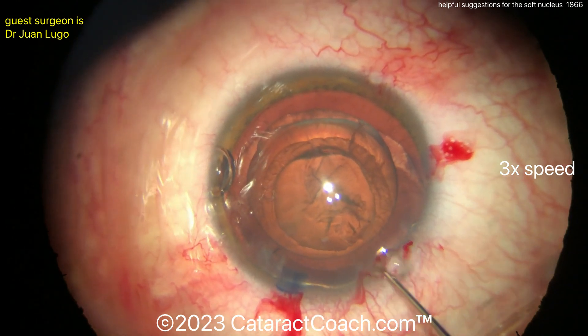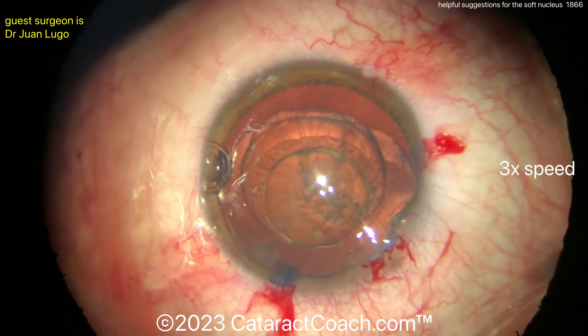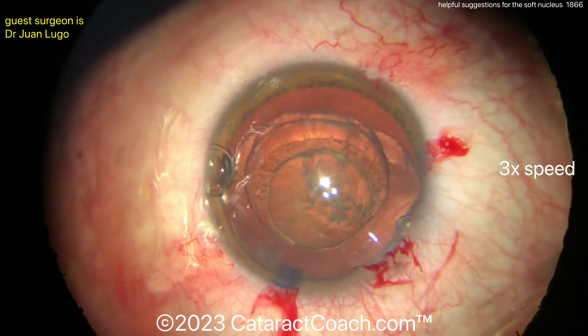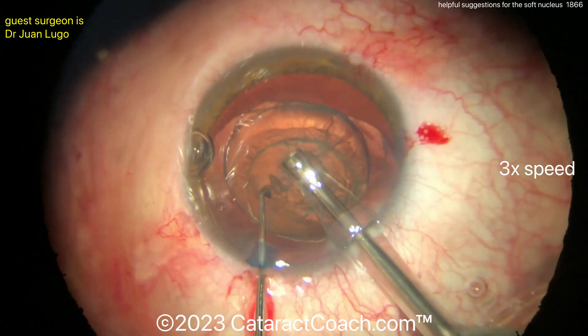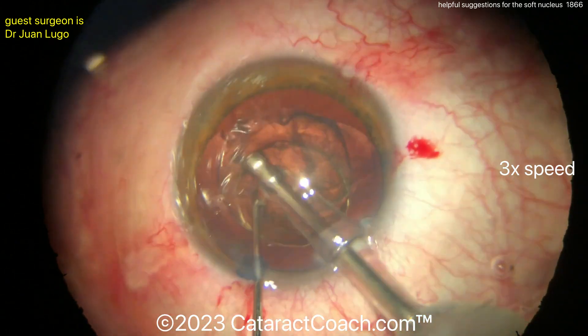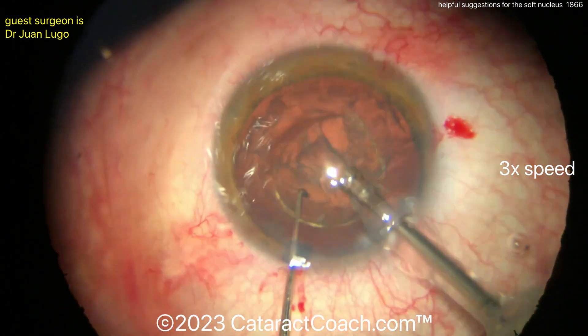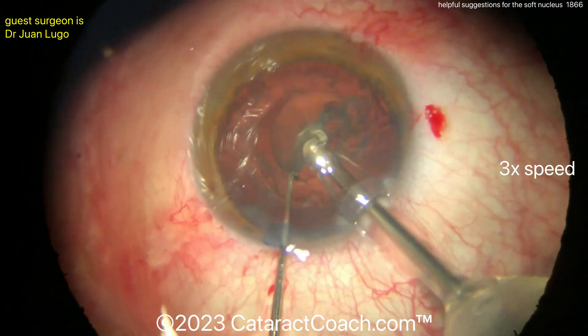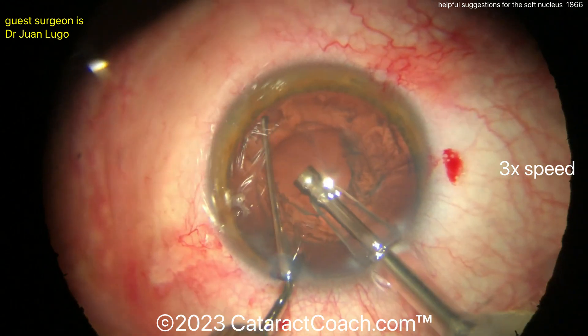This is enough prolapse — you don't have to get it fully out of the bag, this is pretty much enough. The hydrodissection and hydro-delineation have really split up the nucleus now. You can see the endonucleus there in the center. Going in with the phaco probe, just use very minimal phaco energy — you're just going to vacuum this thing down. You should be able to carousel it into your phaco tip. I want to bring it up out of the bag.